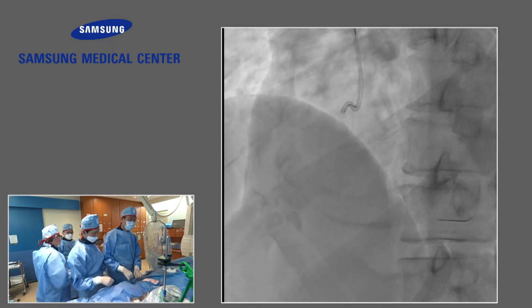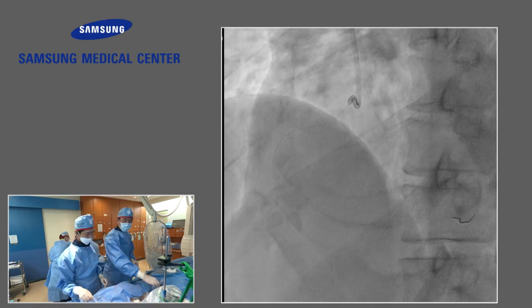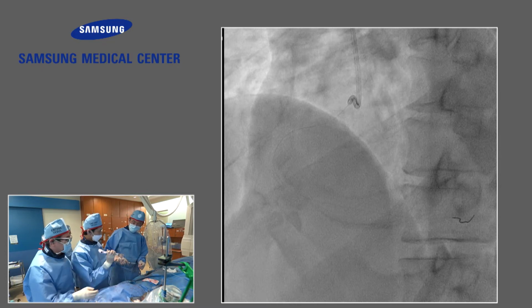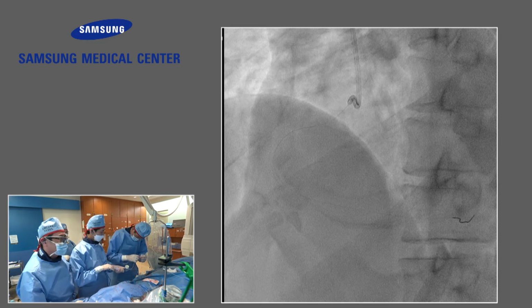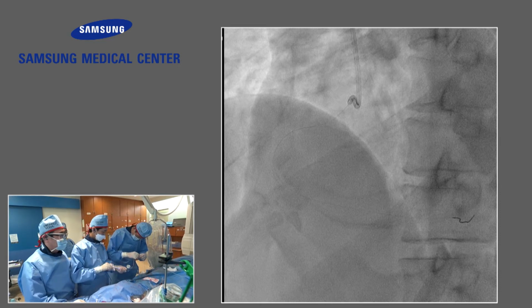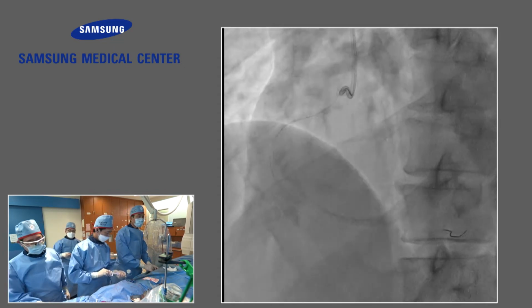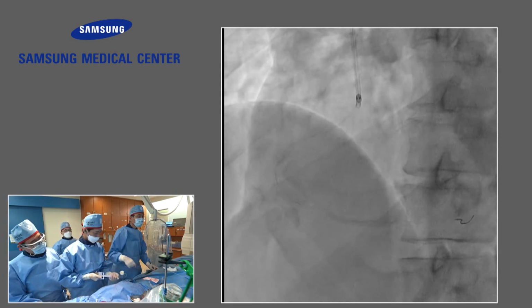2.5. It could have been worse. So my usual NATO technique. 14 atmospheres. Inflate. Very smoothly going out.